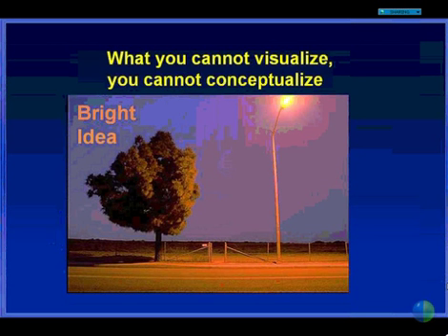To further elaborate on that question, he asked, do you use directed ICG to RAPs or polypoidal? So the answer is yes, especially polypoidal. ICG is indispensable for diagnosing polypoidal, and it's a lot more common in Caucasian AMD than we think in America. It's very common, of course, in Asia, but I think it's more common than we've diagnosed previously here. For RAP lesions, we find it useful to diagnose RAP. Most RAP lesions respond well to anti-VEGF therapy, but there are those patients that require treatment once a month or once every 6 weeks. And we do find that ICG-directed PDT to RAP can be a useful adjunct for that subset of patients that either fail to respond to anti-VEGF or need too frequent injections with the RAP lesions. We don't routinely do it, but it comes in handy enough of the time that it's useful.